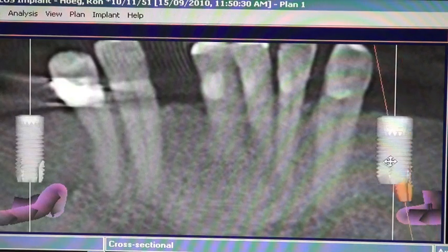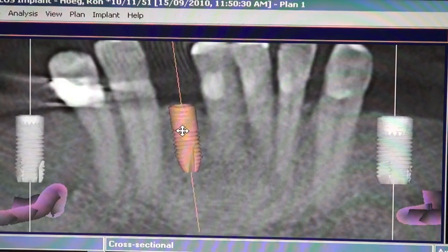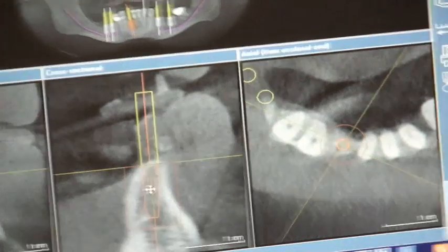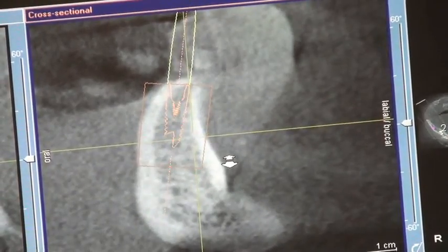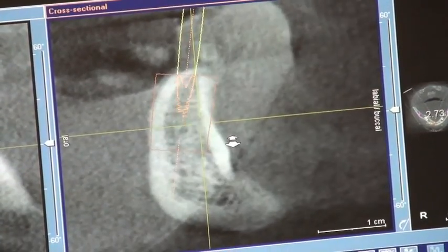We use a cone beam scanner to take a scan of the patient and then check using a dummy implant to see if the patient has enough room for the Nobel Active implant. Looking here we can see that there's enough buccal bone and enough lingual bone, so the angulation of the implant could be quite acceptable.